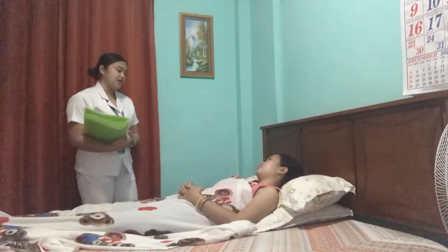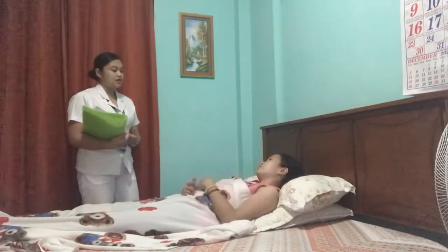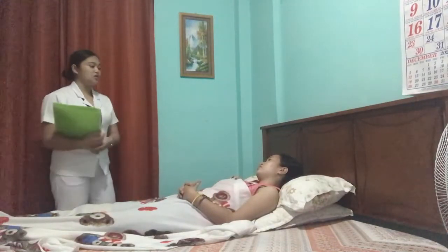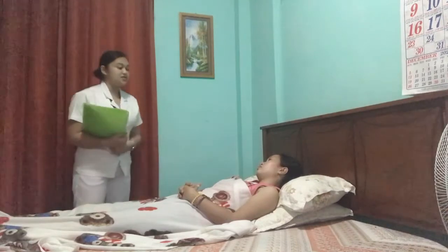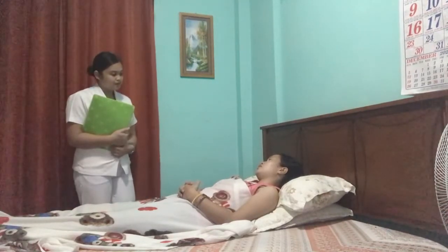It means that I'll be injecting in your shoulder because it allows the medication to absorb quickly in your bloodstream. As you can see, we already closed the curtains and the door so that no other people can see us during the procedure. So, let's start the procedure. Is that okay with you? Yes, nurse. Okay.